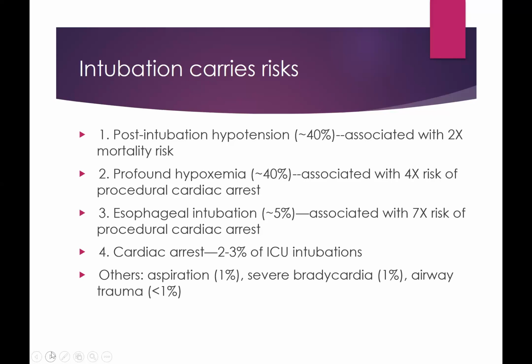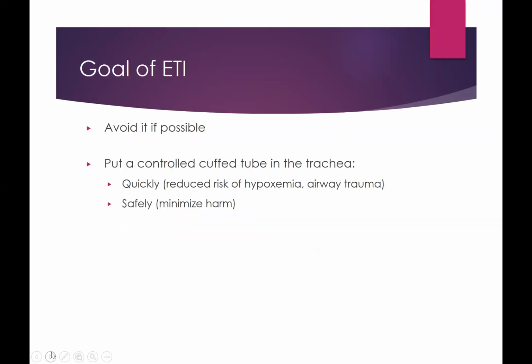But like I said, it is very common for me to see patients get hypotensive. It is very common for patients to get hypoxemic. And so a lot of the things that we do during intubation help mitigate those from occurring, so that we can maintain a lower risk of mortality and a lower risk of cardiac arrest during this procedure. So let's go on and look at, what is the goal?